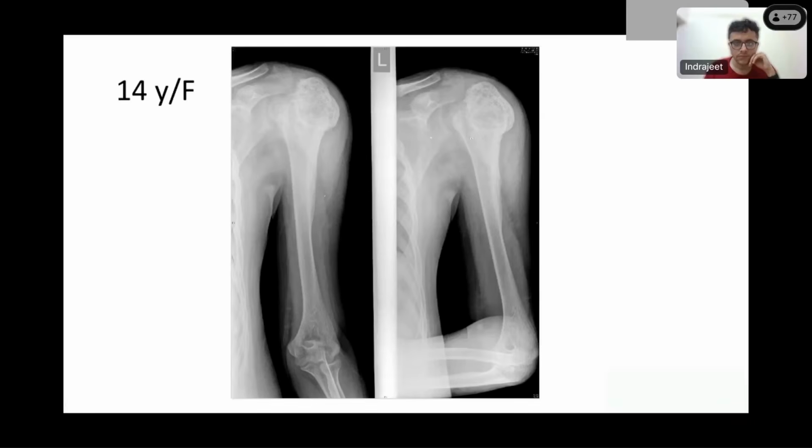Now it looks like a big, well-circumscribed, well-marginated lesion that's just sitting on top of the humerus, right? And immediately this tells me, is this an osteochondroma? Is this a sessile osteochondroma? You would turn and take a lateral view, and sometimes you'll see this little stalk, which makes this entire osteochondroma, the marrow continuing with the bone. And that's the hallmark which tells you it's an osteochondroma. And oftentimes, if it's clearly an osteochondroma on X-ray, we wouldn't do an MRI.